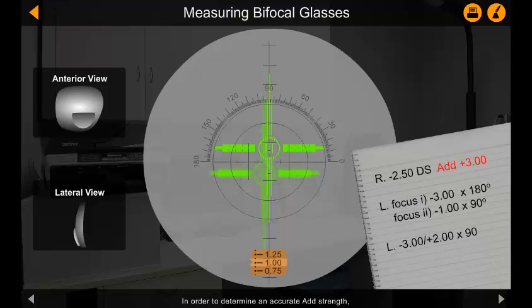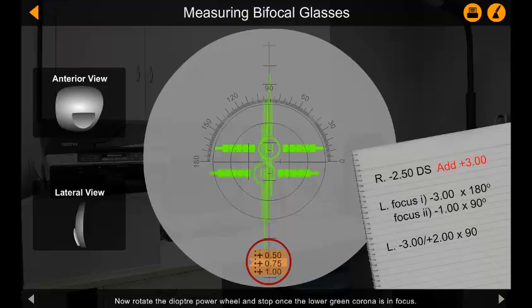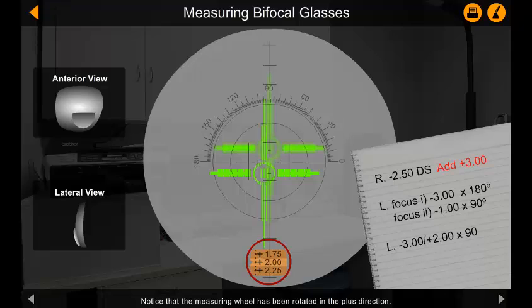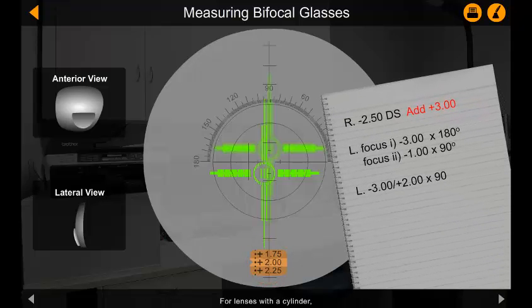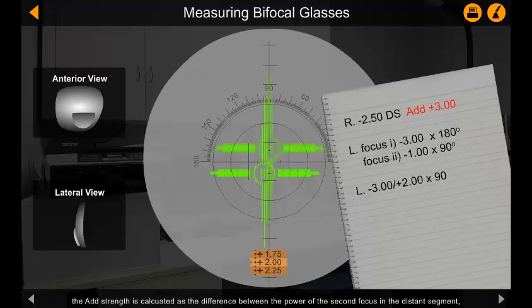In order to determine an accurate add strength, we will begin by taking the reading from the second focus. Note the value on the diopter scale. Now rotate the diopter power wheel and stop once the lower green corona is in focus. Notice that the measuring wheel has been rotated in the plus direction. For lenses with a cylinder, the add strength is calculated as the difference between the power of the second focus in the distance segment from where we started the measurement and the current diopter scale value. The add is therefore plus 3 diopters.